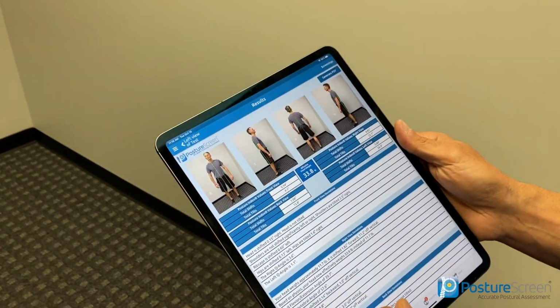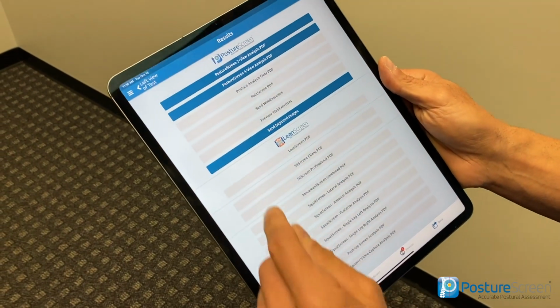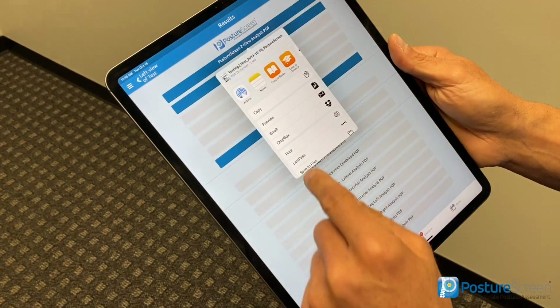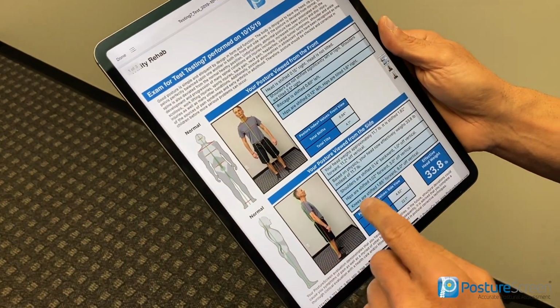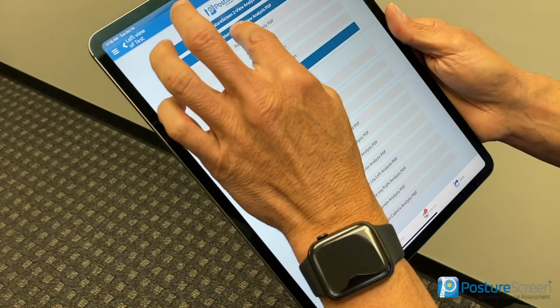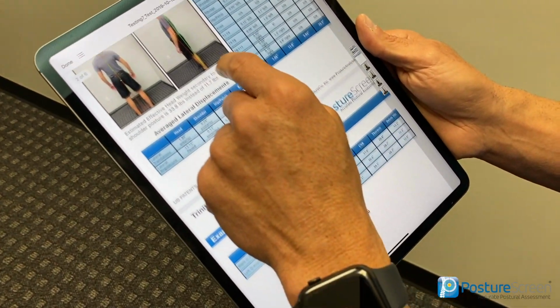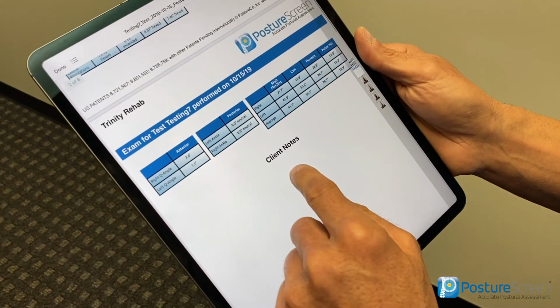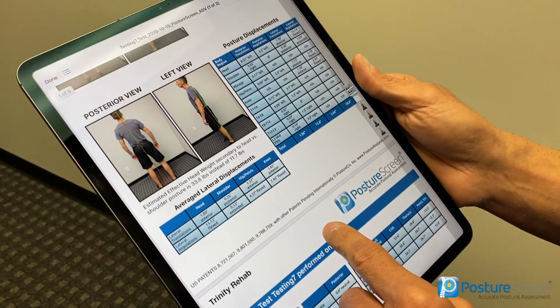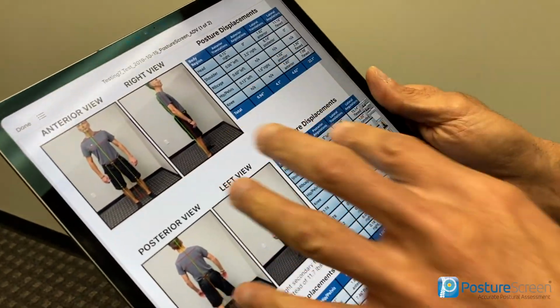Now here's the key. This is a lot of data. So when I send this to a patient, the only thing I send to the patient is the four-view assessment. That's the only thing that I'm going to send to them. Do not, I repeat, do not send the patient this report, which is the clinically relevant one, because this is not made for patients to understand. This is for clinicians and high-end fitness professionals, because all it is is data points.